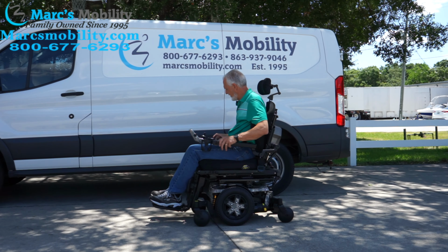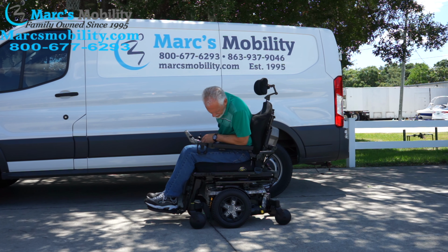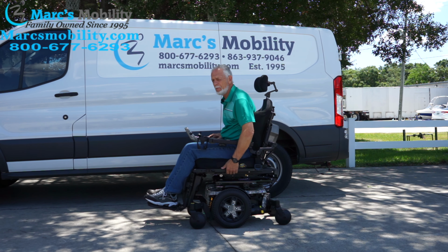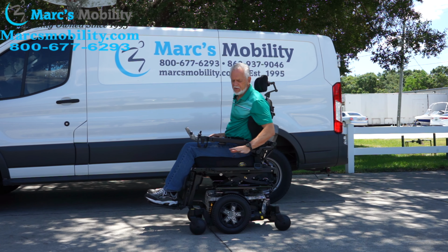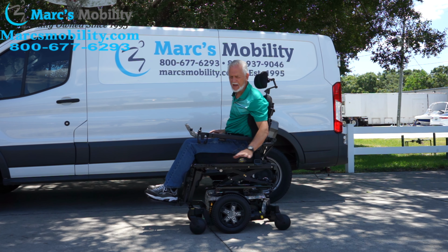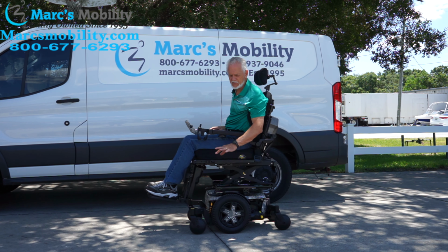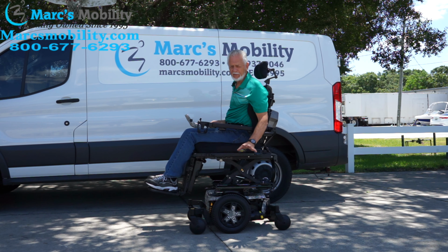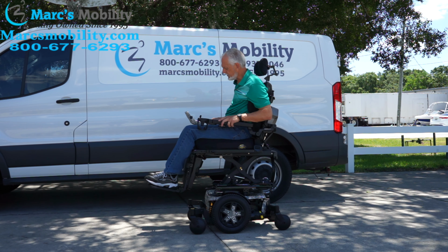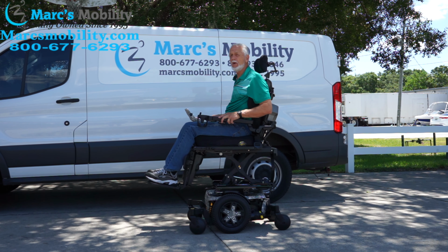So what I'm going to do now is elevate the seat so you can see the seat's going up right now. So if you're going to drive this chair outside, please drive it on a flat surface where the ground is nice and flat. You know, the malls, your house, restaurants, that's fine. They're nice chairs, but we do have to take care of these chairs. They are expensive chairs. So the seat is almost all the way up.